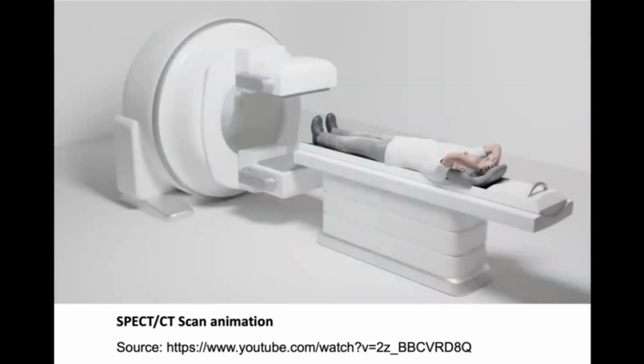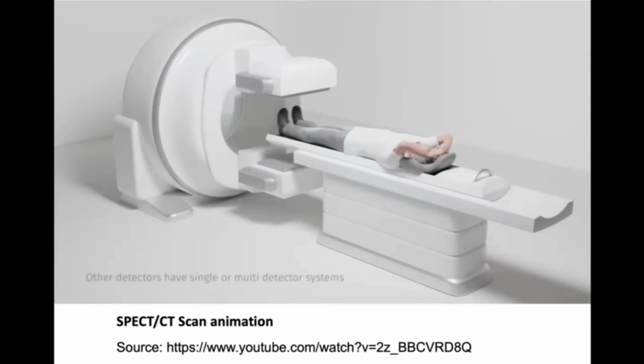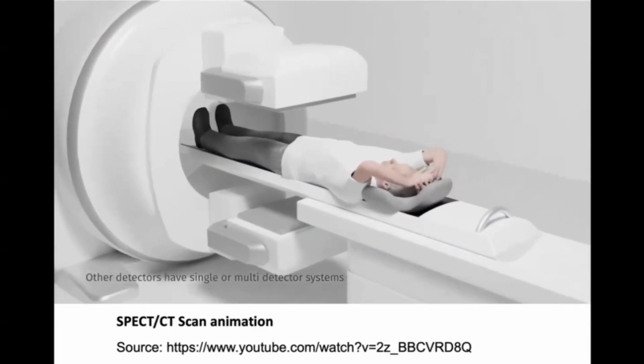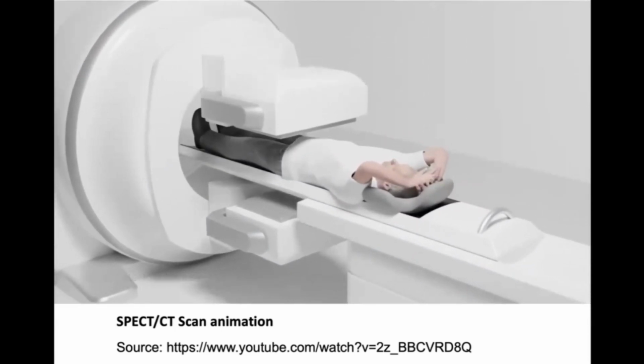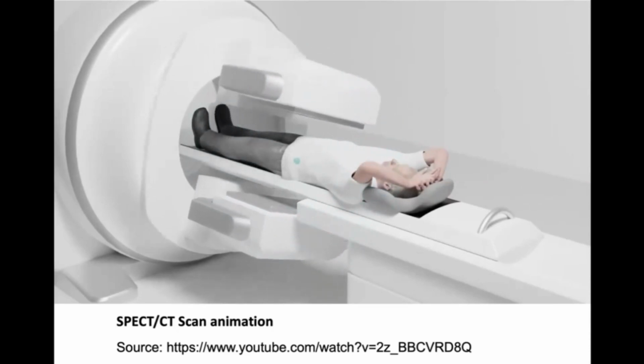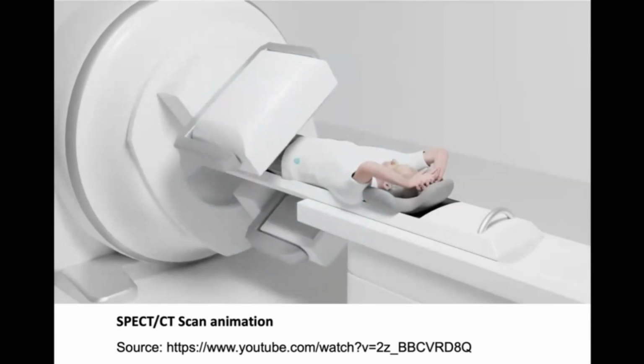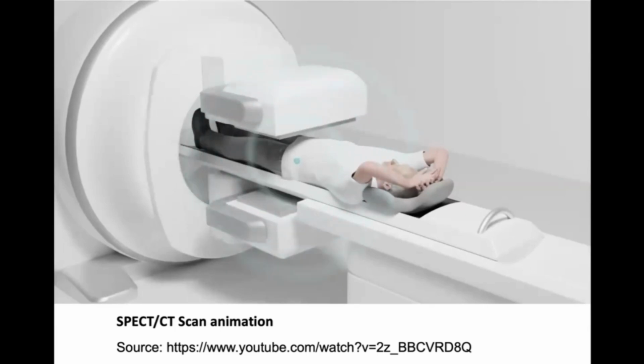For diagnostic scans, the nuclear medicine is radioactive and emits gamma rays that can be detected by the scanner. The SPECT CT machine has two gamma cameras that detect gamma rays and produce a map of how the tracer is behaving. These detectors rotate around the body, taking images every few degrees, allowing images to be reconstructed in 3 dimensions. The SPECT scan can take 10 to 20 minutes, and then the CT scan takes less than a minute.